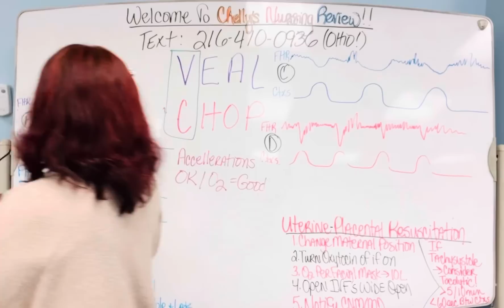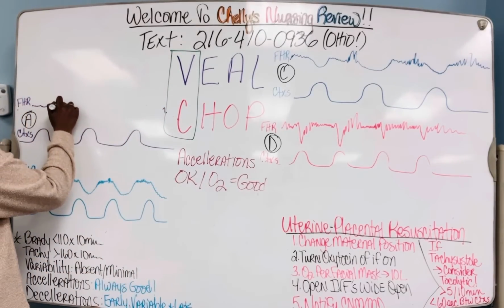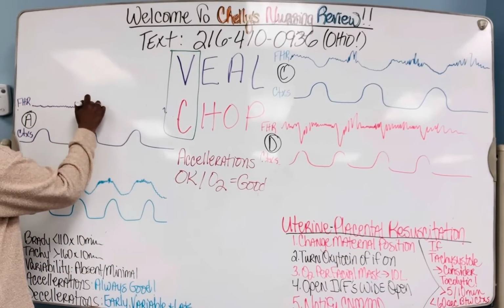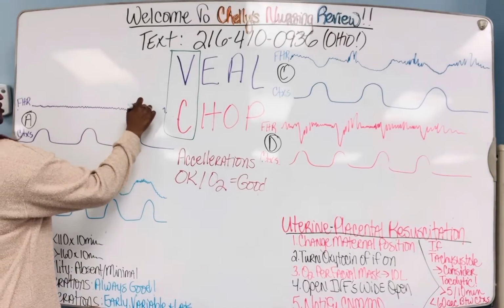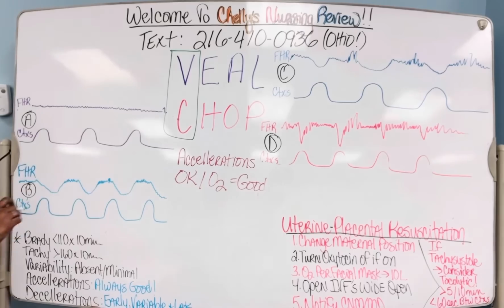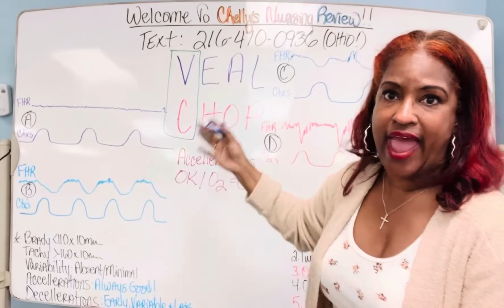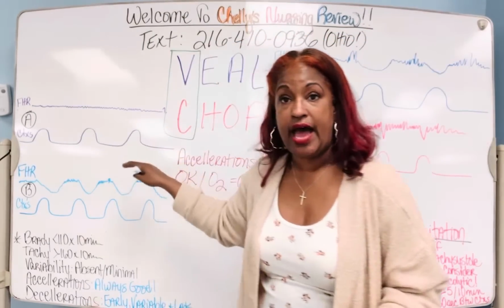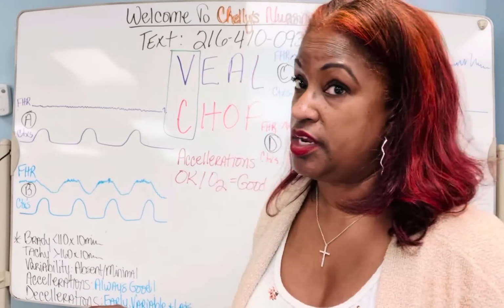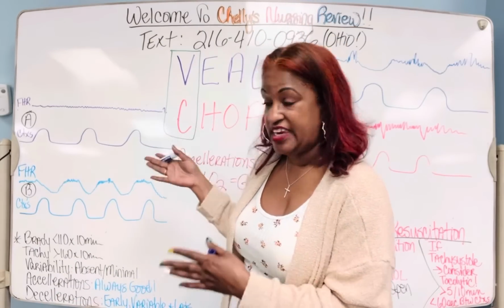Here we go. I am doing the fetal heart rate completely different. In fact, I would even say this is the opposite of what I had up here. If you'll remember, I had this big, wild, wonderful, happy baby pattern. This is almost like a straight line. And you know in adults, straight lines are never good. But what is this in this baby, in this fetus?